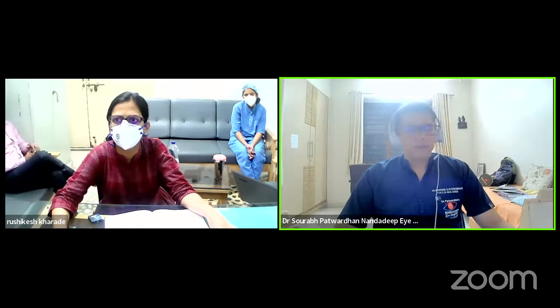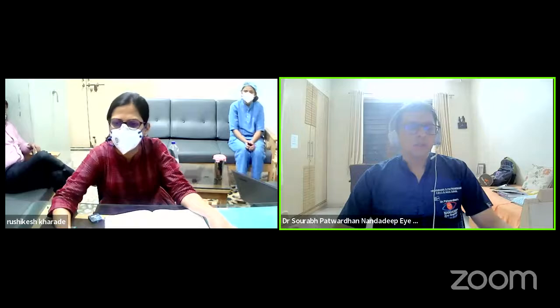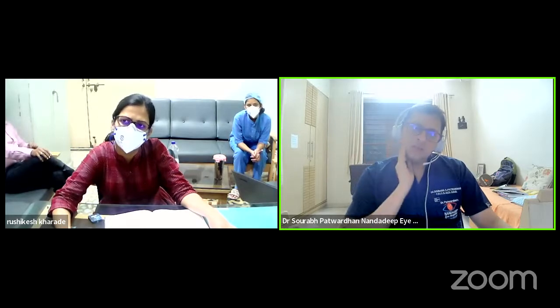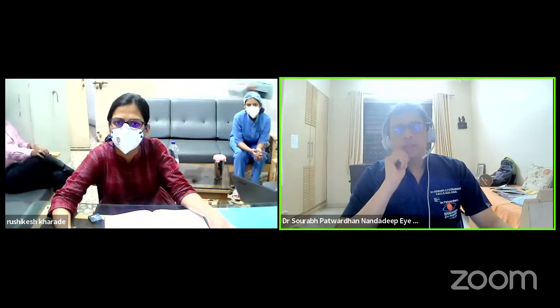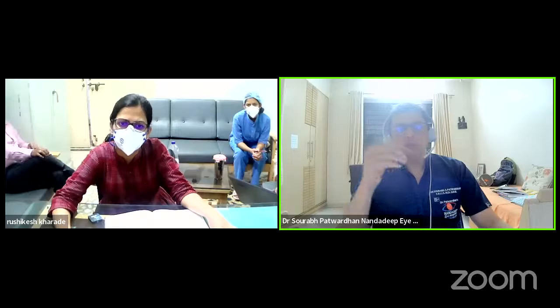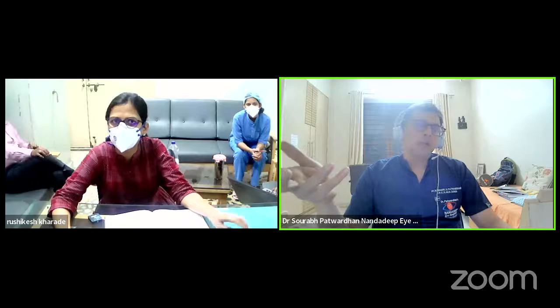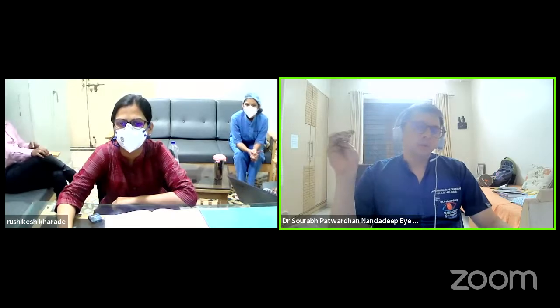Okay, fine. You can leave this video. I think basically it must have happened during hydrodissection only, because there was no other event. So this can be a pre-existing weakness in the posterior capsule. And with a dense nucleus, you have to be very careful with hydro. When you are pushing fluid, the main incision should be pressed, like the posterior lip should be pressed always. Otherwise, even if fluid collects inside and there is a corticocapsular adhesion, then that gets trapped and it will cause rupture of the posterior capsule.